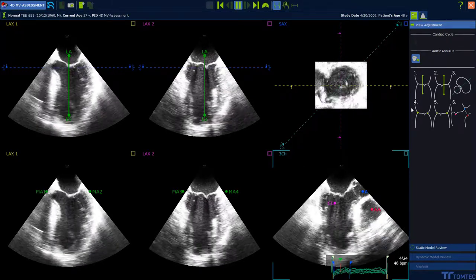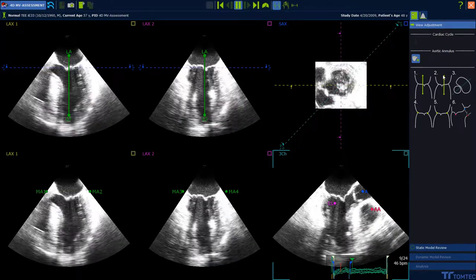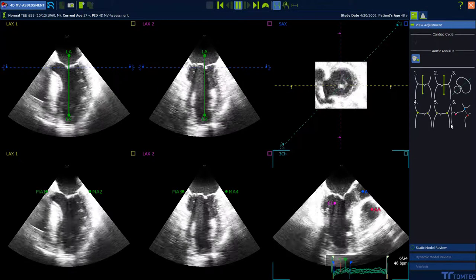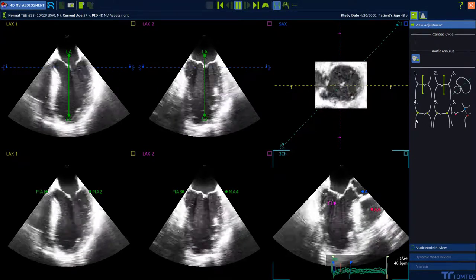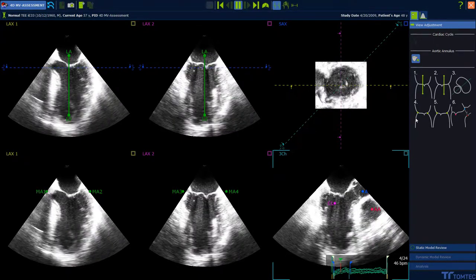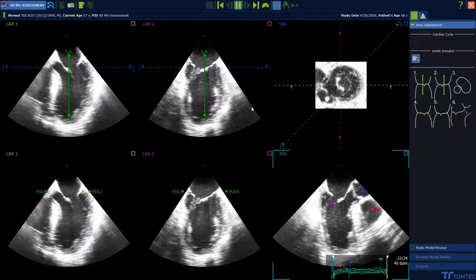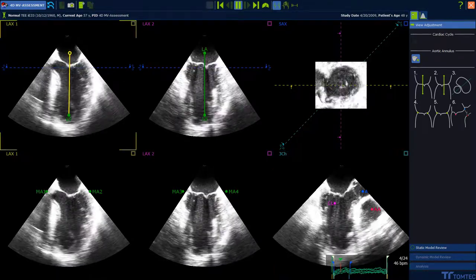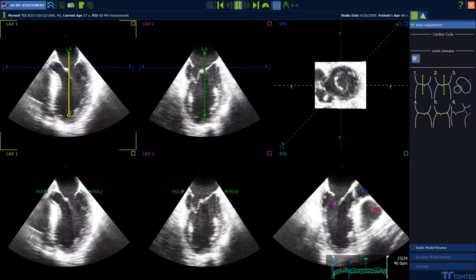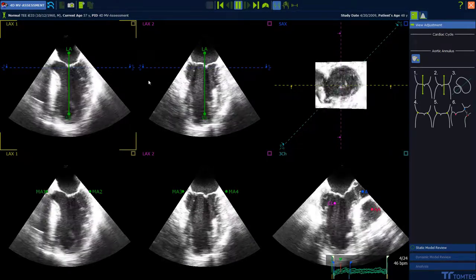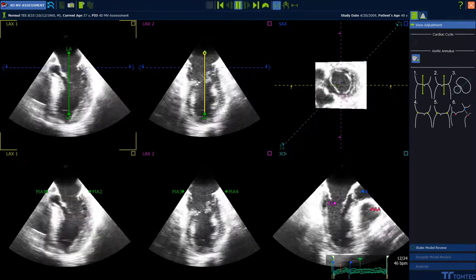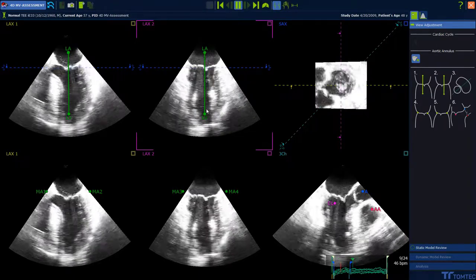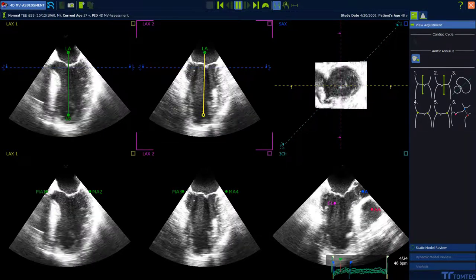Use the helping guide on the right side to place the landmarks. Just note the sequence of images. Reposition the landmarks if necessary by drag and drop. In each view, the mitral valve annulus must be orthogonal to the green lines.